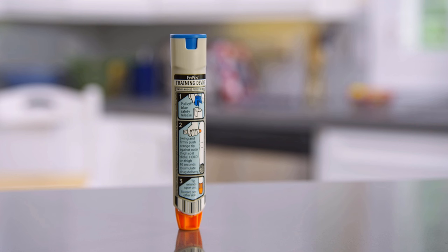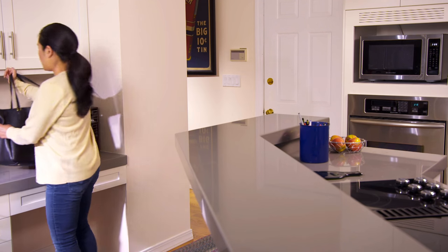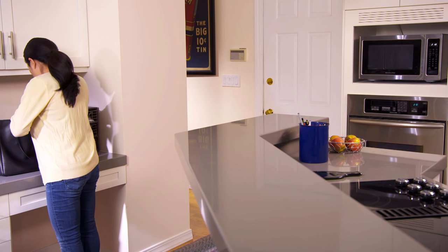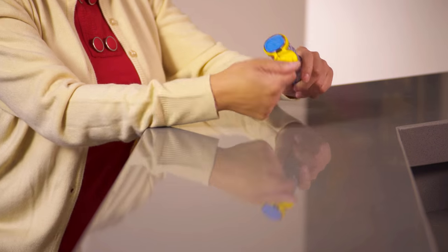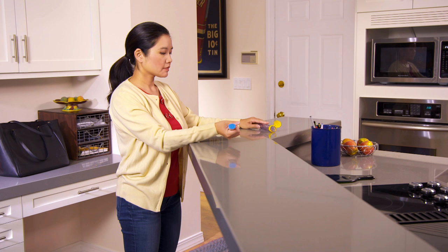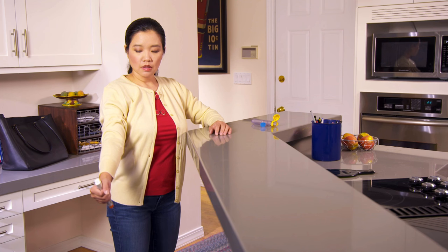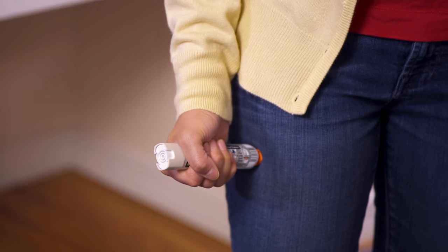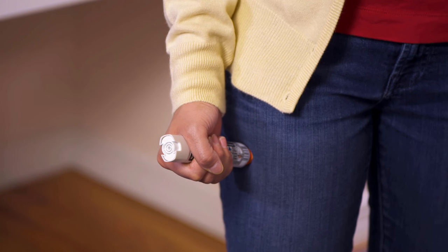If you know you have a severe food or other allergy, you should always keep your auto-injector nearby. If you're having a reaction, get your auto-injector as quickly as you can. Slide the injector out of its tube. Grip it in your fist, orange or yellow tip down. Then pull off the blue safety cap. Swing and firmly push your arm down so that the orange or yellow tip makes firm contact with your outer thigh.